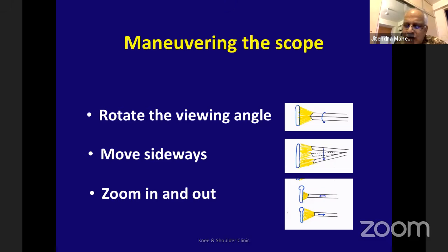A little bit of subcutaneous nerve cut here doesn't bother me, because I know what I want to see inside, so I have to go through that small cut based on what I want to see. So I agree with you that there may be some subcutaneous nerves cut in a vertical portal more often than a horizontal portal, but I don't think that's very significant or important.